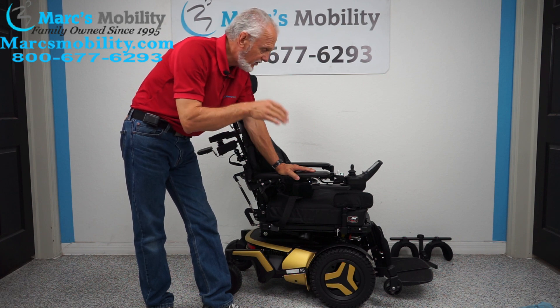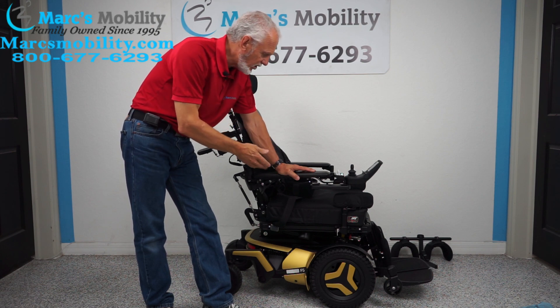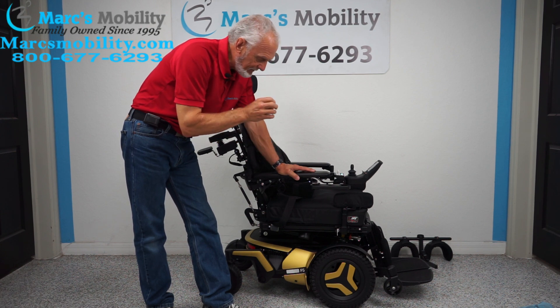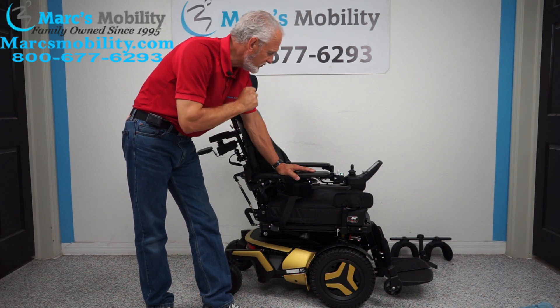This power chair has two miles on it, so it's literally brand new. As you can see, the color is gold, but the color can be changed if that's not what you want, and the whole chair can be sized up. Again, this is the Permobil F5 VS for vertical standing, with seven electrical functions and two miles on it.